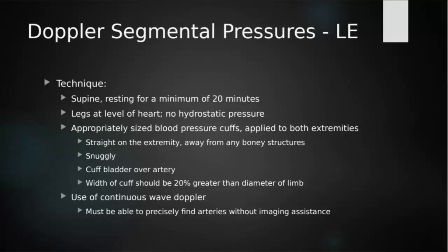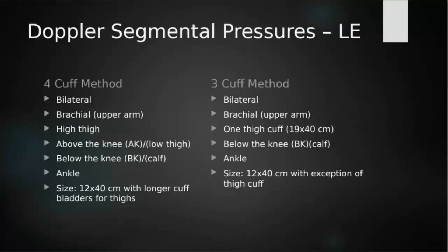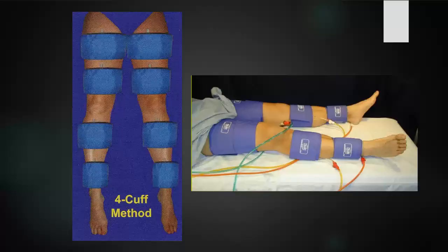Think back to physics. Continuous wave Doppler is constantly sending and constantly receiving, so we're not going to rely on that for any useful diagnostic image. We're using continuous wave Doppler to help us find our arteries without any imaging assistance. So when we're performing this, I kind of want to go forward one slide here, and then we'll go back. So this is what your patient's going to look like. There's a three cuff method or a four cuff method.